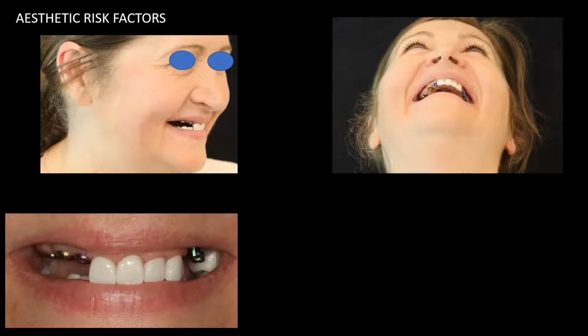Is there an option of extracting the 4 teeth and going to an all-on-4 with an acrylic titanium style frame? I guess that makes a buffer against the lower dentition. Or if you decide to retain the front 4 crowns, then you have to work around it, and you're at a compromise.